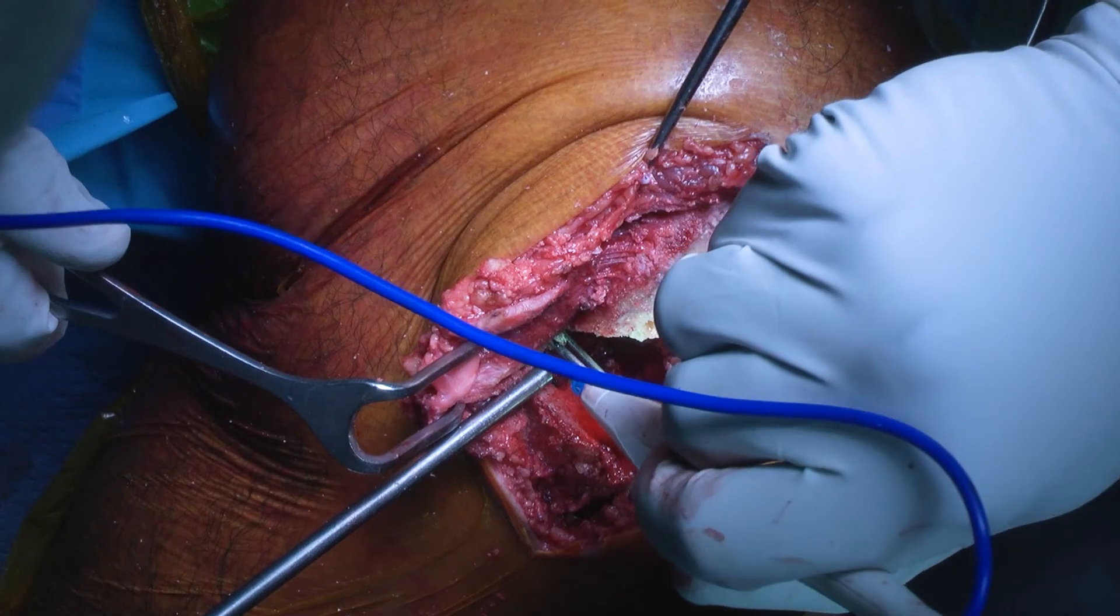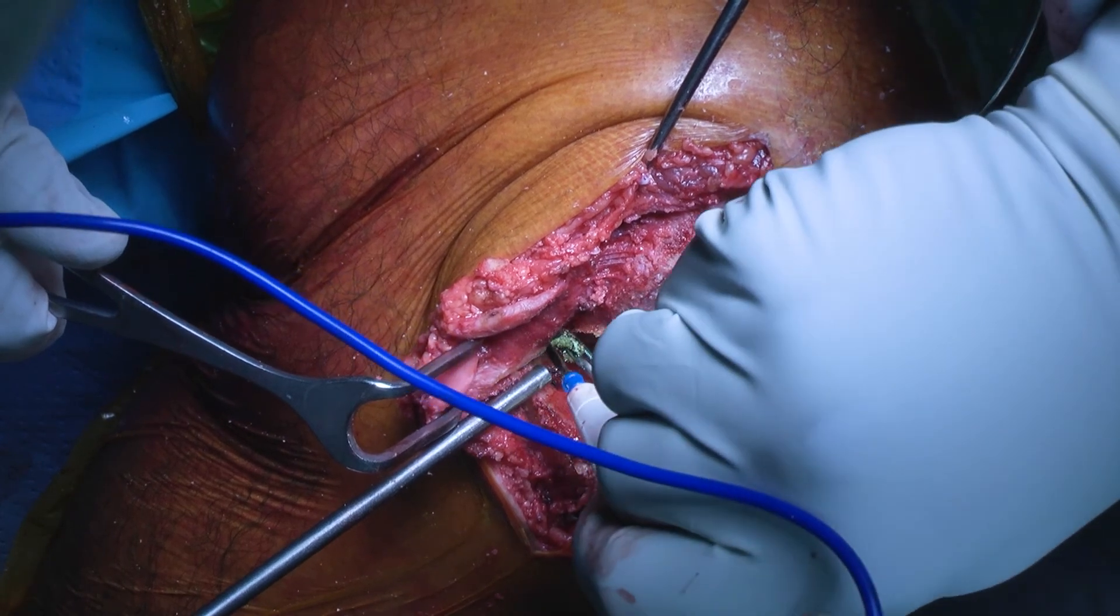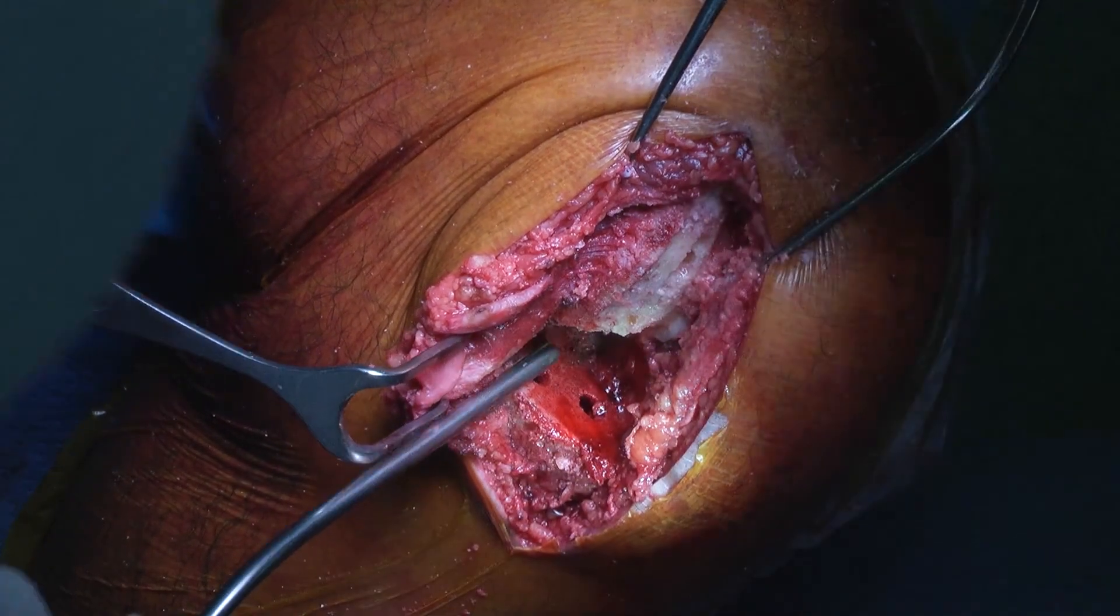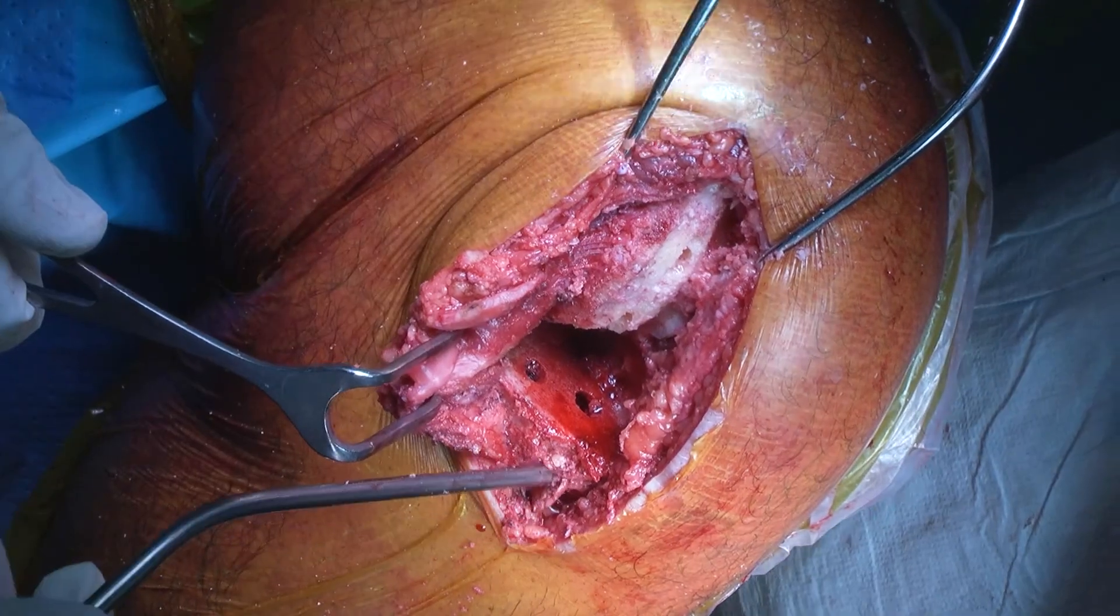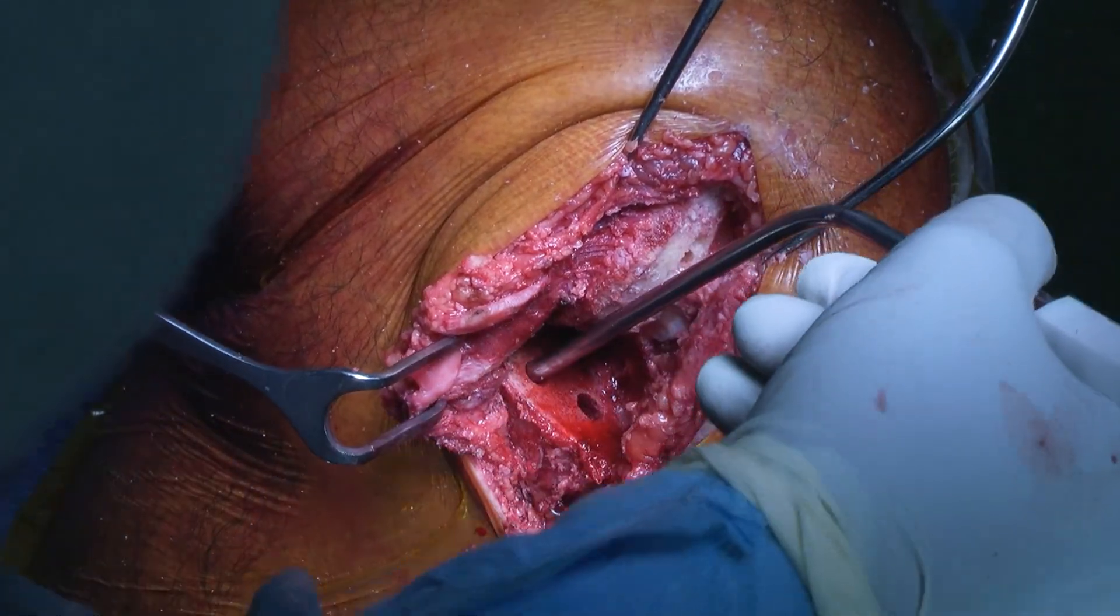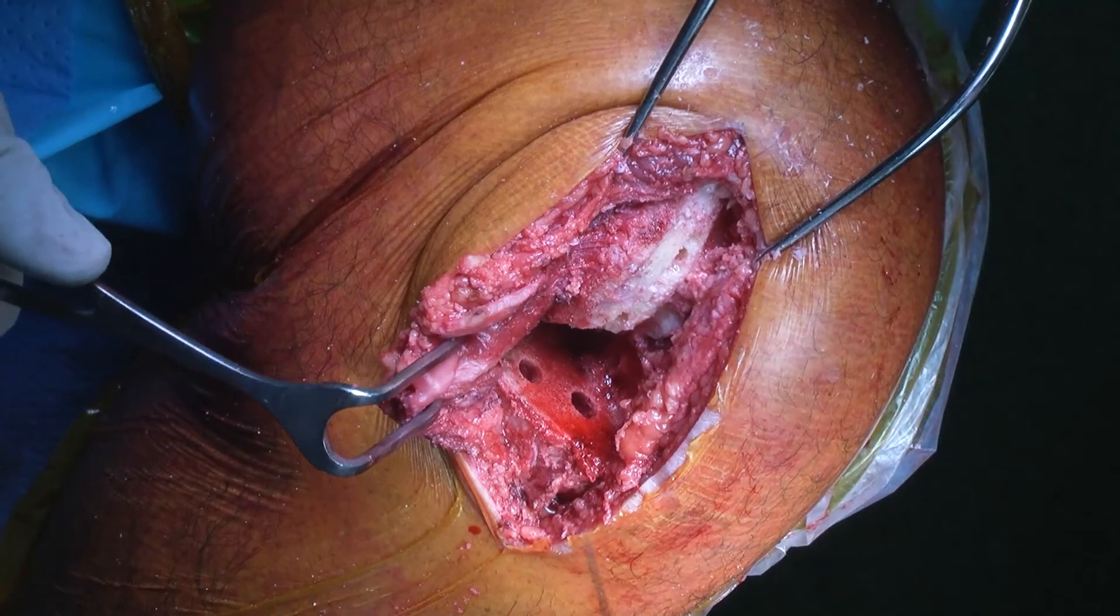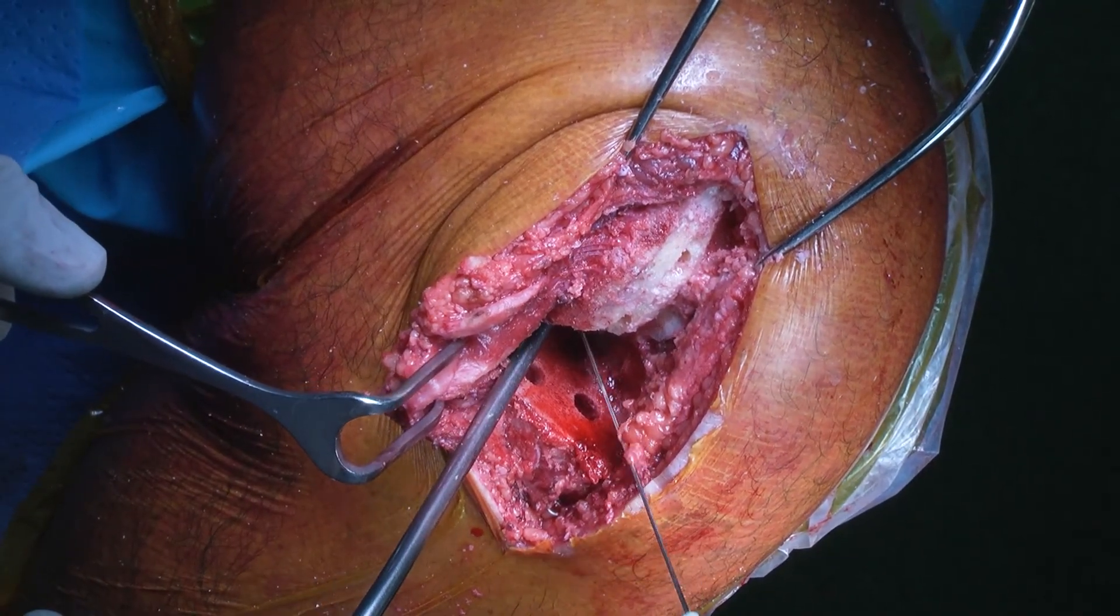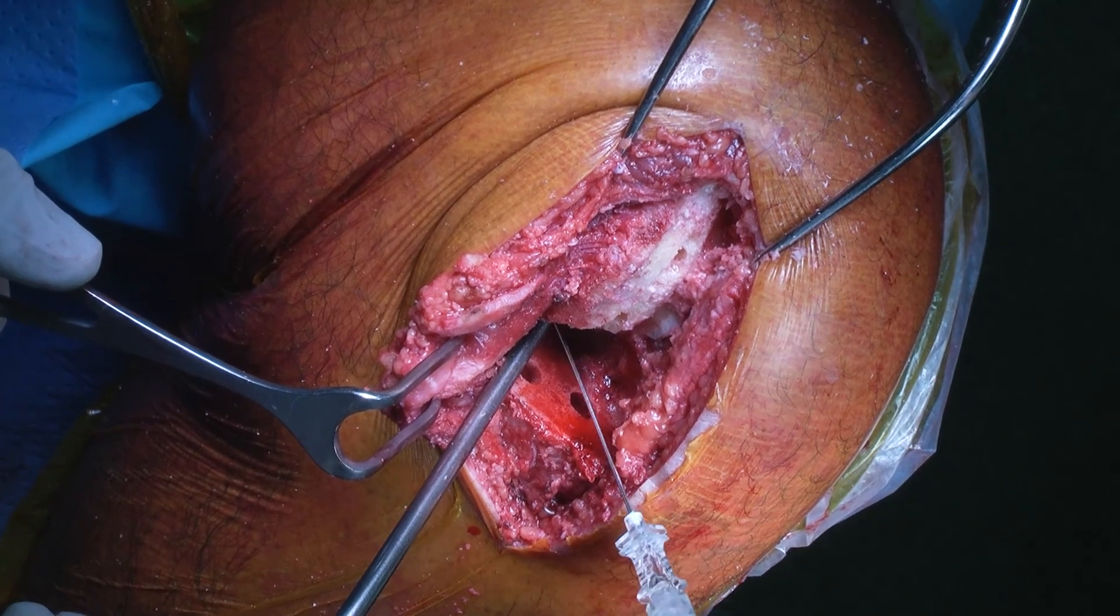Once all the bony cuts are completed, the remnant meniscal tissue and osteophytes are removed from the back of the knee, and the posterior capsule of the knee, as can be seen, is infiltrated with local anaesthetic, which greatly reduces post-operative pain and improves the patient's post-operative journey and recovery.